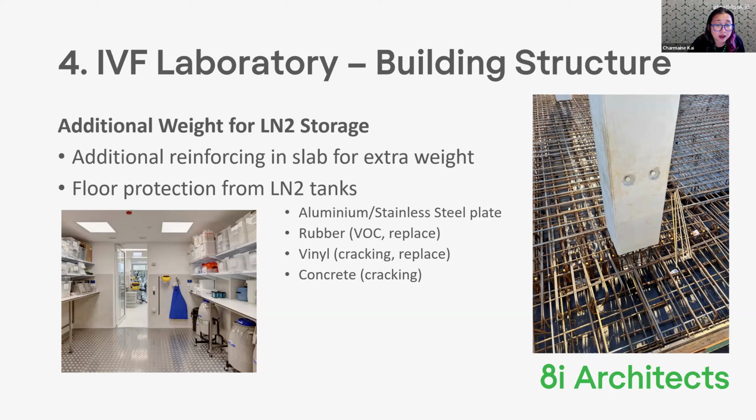So in a lot of my labs, I'll try and use aluminium or stainless steel plates, as you can see in that image there. So the tank room has aluminium and stainless steel plates. The advantage of it is it doesn't crack. It will move, it will shift a bit, but then it'll just go back into place.